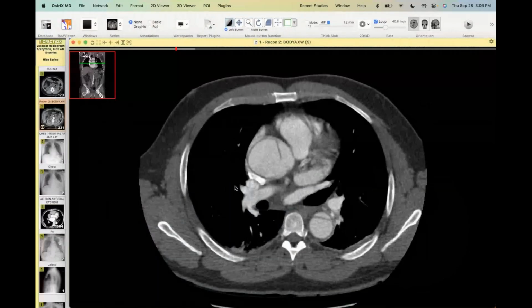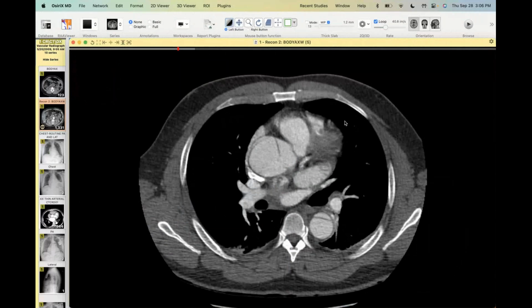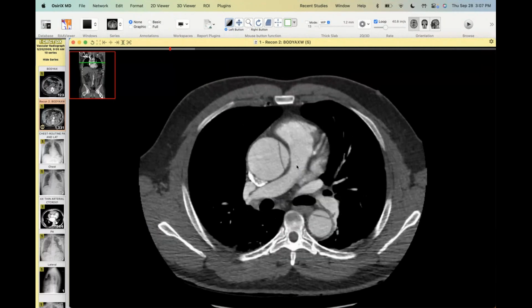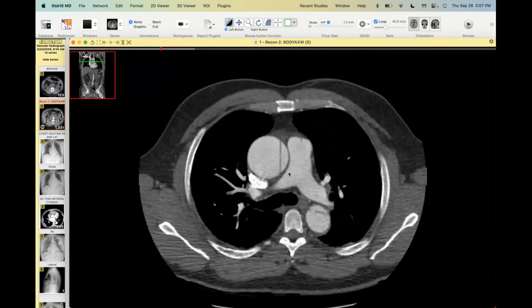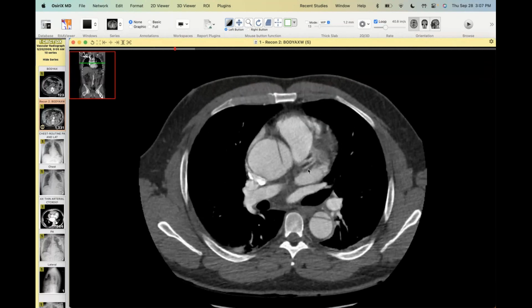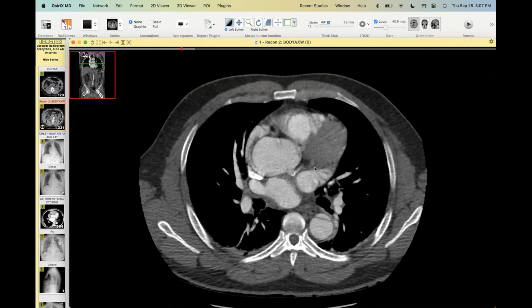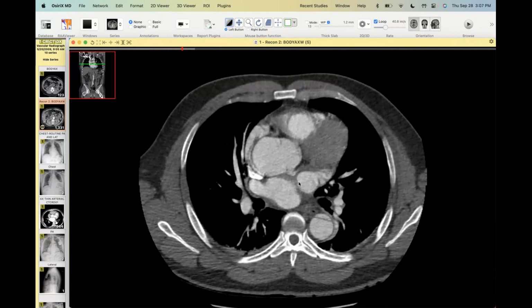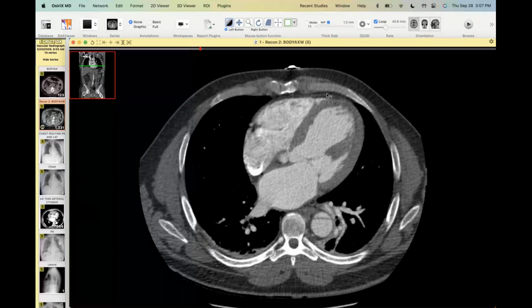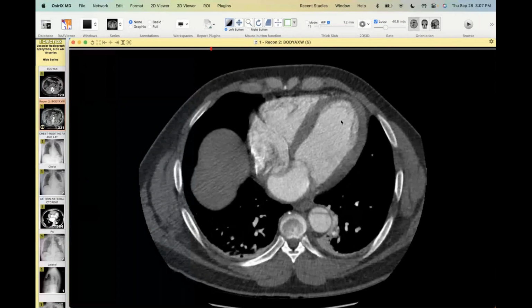So this is a patient who originally presented about 14 or 15 years ago with a type A dissection. You can see an entry tear just above the sinuses. They also had coronary disease. In their left main, they've got some calcium. It's hard to see on this. I don't think the dissection was actually involving the coronaries, but you can see a little thinning, some fatty metaplasia, so they've had a prior infarct.